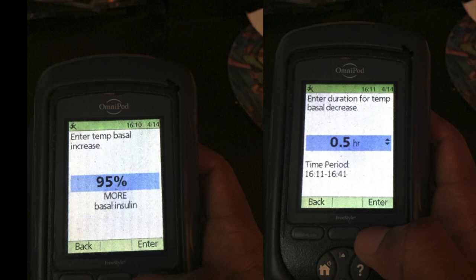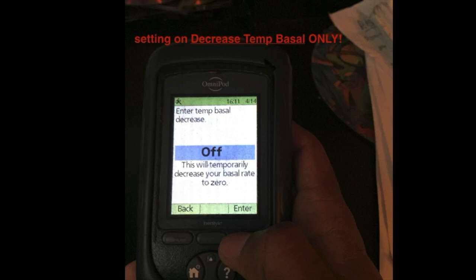There's a caveat with decreasing — you can decrease it to where it's temporarily off. So if your blood sugar is bottoming or really low, which mine does quite a bit, you can turn it off. But this will only be temporary and it'll turn back on automatically. This is why I like this more than suspending the Omnipod. This option is only on the decrease setting.